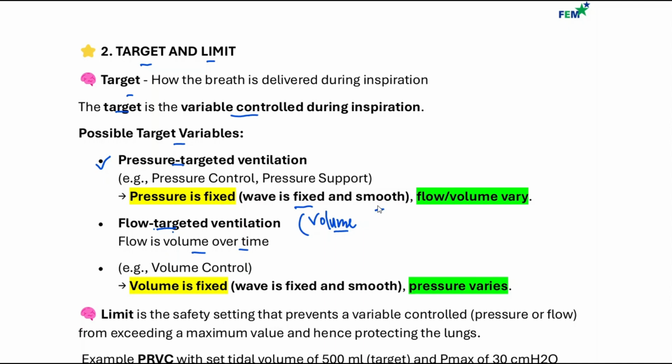We are not controlling the volume, so the volume becomes variable. When you look at the waveform of the volume, it can change from breath to breath, depending on the patient's lung mechanics.